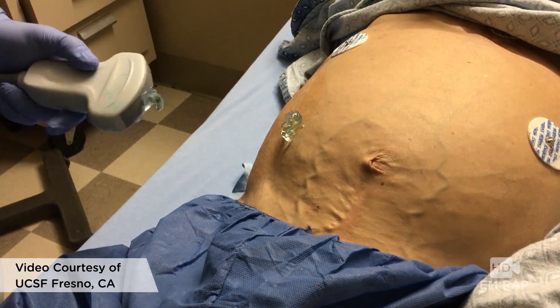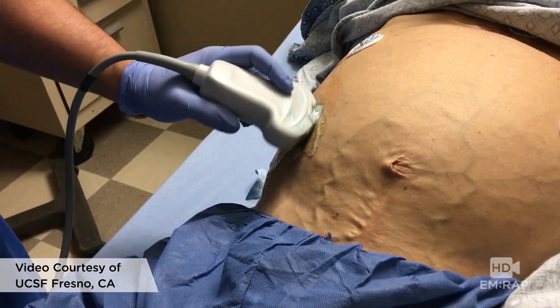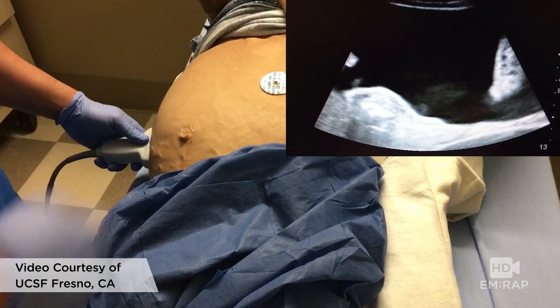To do a therapeutic paracentesis, first take a look with the ultrasound and find a pocket of fluid that looks safe. Avoid those superficial veins and important stuff like bowel and omentum. If you turn the patient slightly towards you, the bowel will float up, and use whichever lower quadrant looks better on ultrasound.